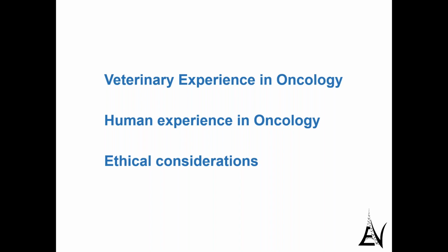So in this sense, orthovoltage, because the price of the shielding is smaller, because the size of the room needed for orthovoltage is smaller, was adapted to these considerations. And then you have to think of the ease of use of the machine, but not for you, for the pet. And how long is the anesthesia, etc. And as a vet community, we want to propose some options of treatment that could be used in as many patients as possible, and used by as many clinics as possible.